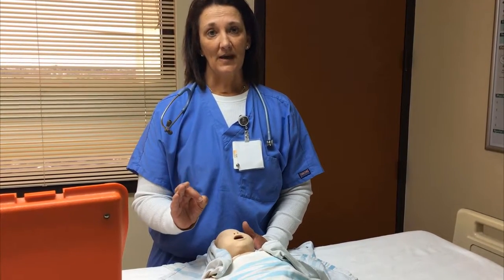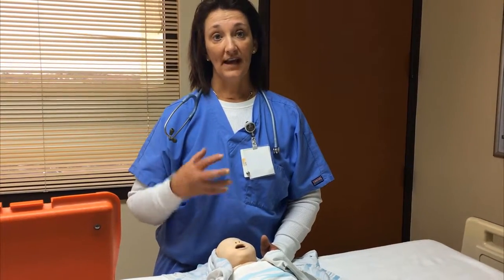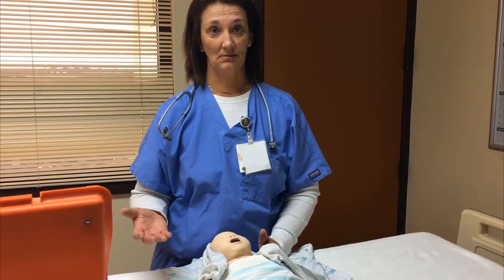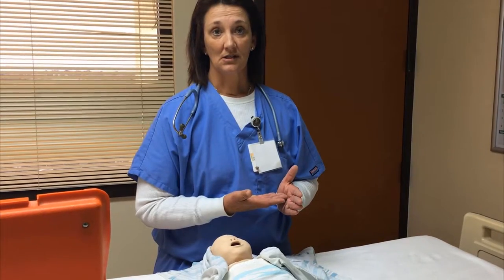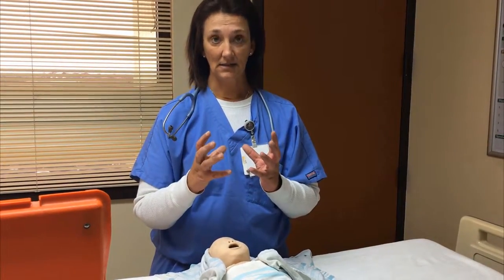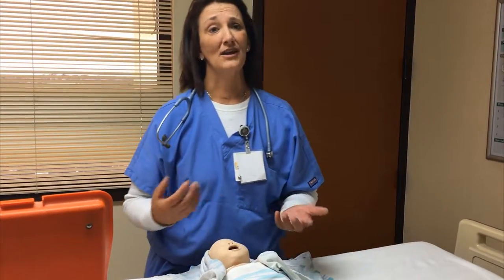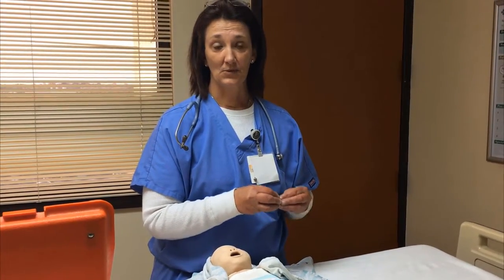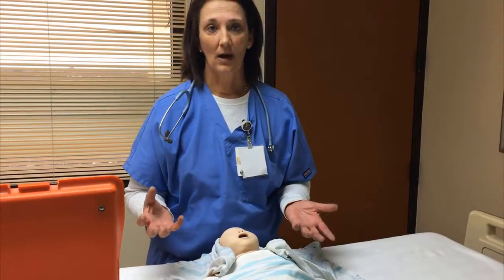What you need to know about CPAP is what PEEP is. PEEP is the amount of air that is maintained in the lungs between each expiration. So what CPAP does is it infuses oxygen during expirations to make sure alveoli in the lungs don't collapse. Oftentimes, premature babies do not have enough surfactant, so their lungs will collapse between expirations, and term babies can experience this too. Let's review how we do CPAP.